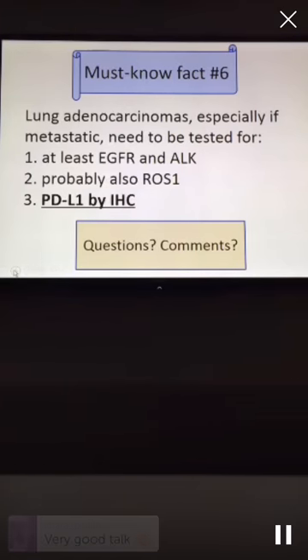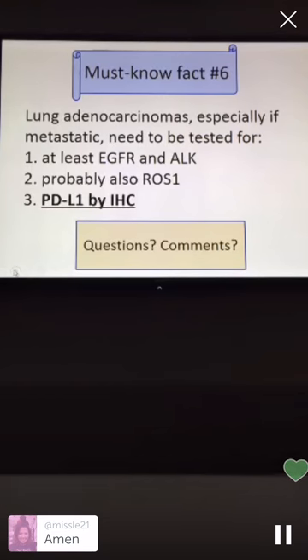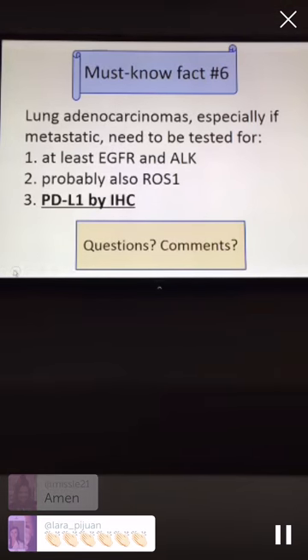And some of the drugs that are out there are based not only off of reading the percentage score with the tumor cells, but also reading the percentage of the immune cells that are in the slide, like lymphoid background, which, if you think that's challenging in histology, could be even more challenging in cytology. True. And they're diagnosing many of these patients, especially people presenting with metastatic disease, on tiny little biopsies or FNAs, because all they want to do is confirm that it's a malignancy. Right. And then they want you to do all this magic off of that sample, which could be difficult.